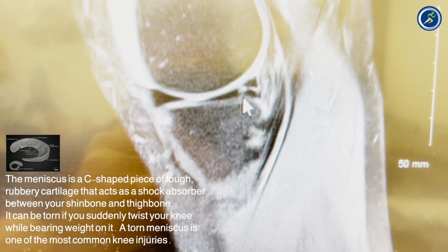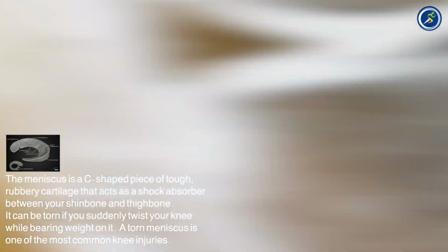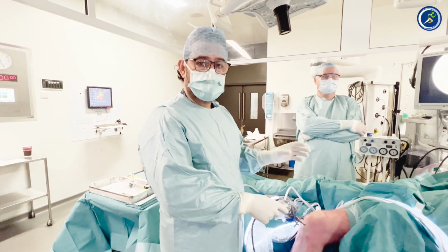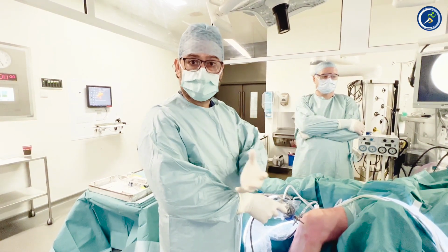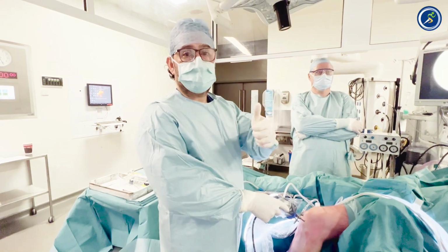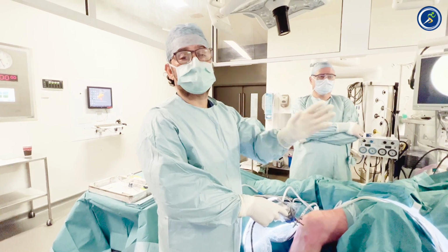And then we will show you how we save this meniscus by repairing it with the help of stitches. So this young patient, we are about to start looking at the knee, and when we looked inside the knee, because of the meniscal tear, he had multiple synovial inflammation, which we cleared. And now we are going to show you inside the knee, if meniscus tear is delayed, what it can cause to the knee joint and how it can cause damage to the meniscus.